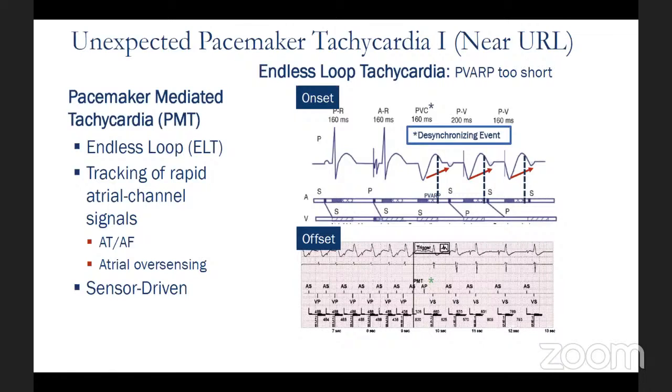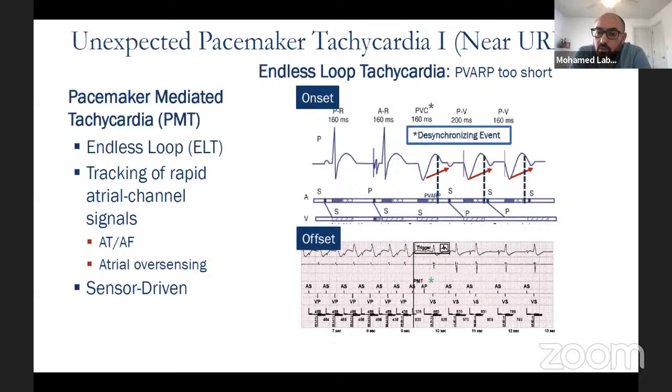And do you use, for example, a temporary pacemaker to support the patient, or do you just add the new leads and then remove the old leads? It depends on how old they are. If the device is within two years, and looking at the x-ray there's nothing strange about that lead, I think it will just come out. I will put in the ICD lead and just pull the pacemaker lead out. I don't have a laser lead extractor where I practice. If I think it's an old lead, I just send it to an extraction center. We don't have it in my center.